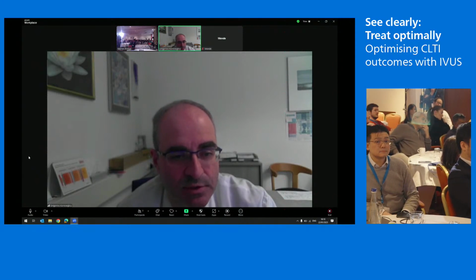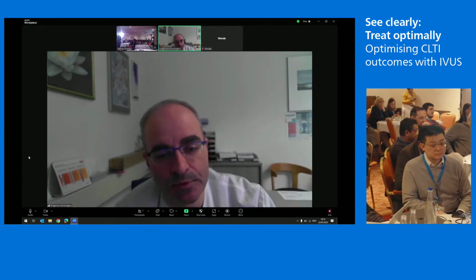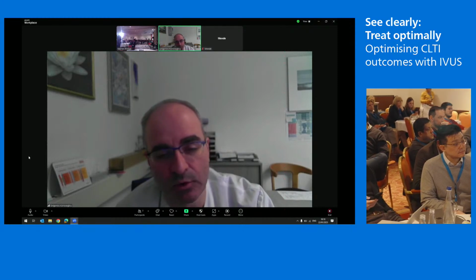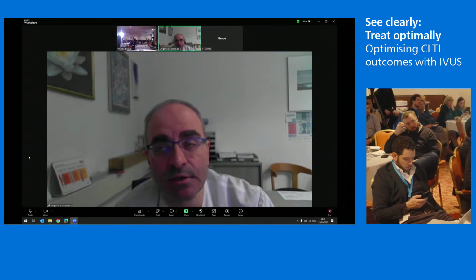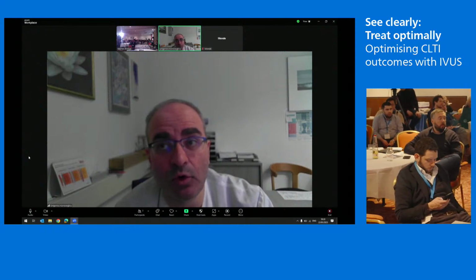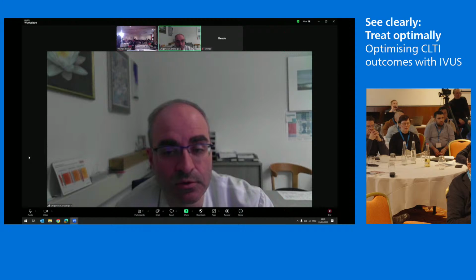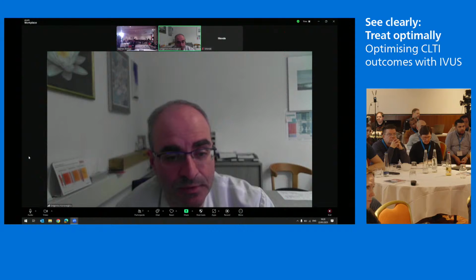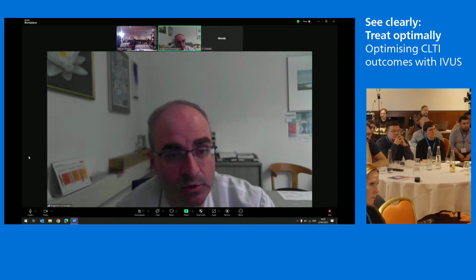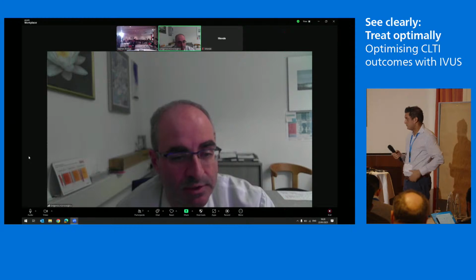Optimally, because these catheters are not very long. So if you are going crossover, you might get difficulties. You may not be able to get so deep into the lesion. So in that case, you either need to perform an additional antegrade puncture in order to do manual aspiration, or you need to have thrombectomy devices in your lab in order to address these complications. For example, a Rotarex catheter for bigger vessels or a Penumbra device for smaller vessels.